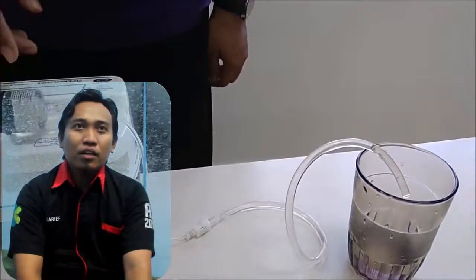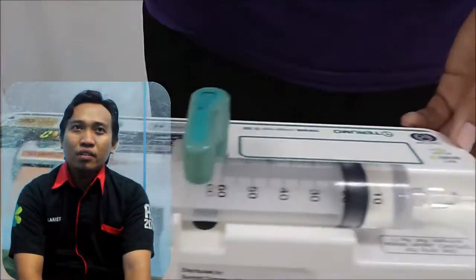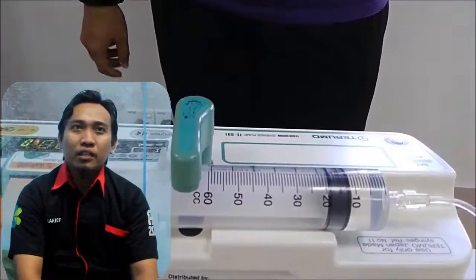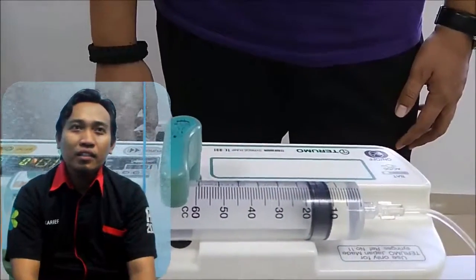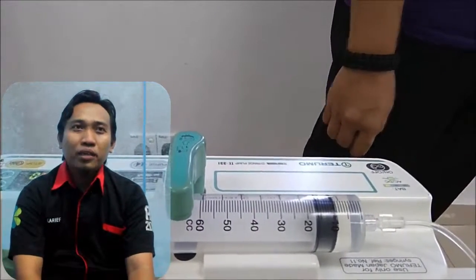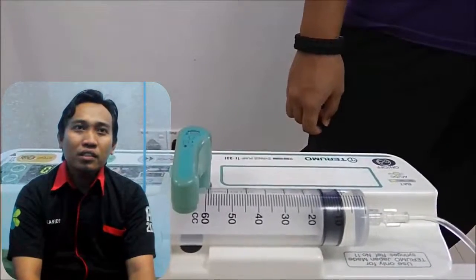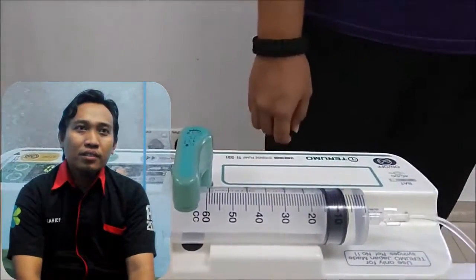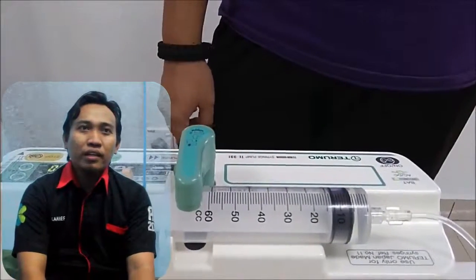The focus of attention on patients who are given drugs using a syringe pump, which needs to be considered in the patient and the equipment: 1. Pay attention to the general condition and complaints of the patient during therapy. 2. Make sure the drug calculation is in accordance with the requirement, with the dilution done. 3. Make sure that when giving the drug using a syringe pump, the dose is entered in the form of cc per hour so that the dosage is provided as needed. 4. Dilution of the drug is done to make it easier to give the dose as needed.